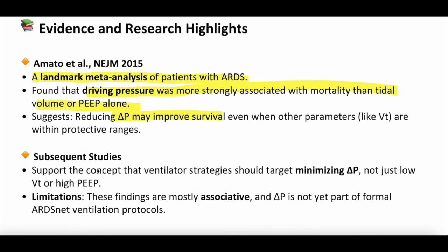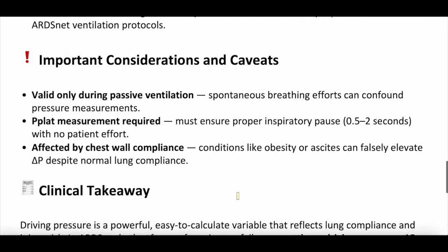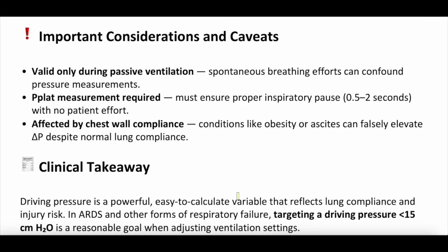There's been subsequent studies that kind of support this concept that you should be targeting a lower driving pressure, not just tidal volume or PEEP. But most of these are associative studies. There hasn't been, at least as far as we're aware, these robust RCTs, although they probably will be coming, so stay tuned. When we think about important clinical considerations and caveats, again, this is really only valid during passive ventilation.